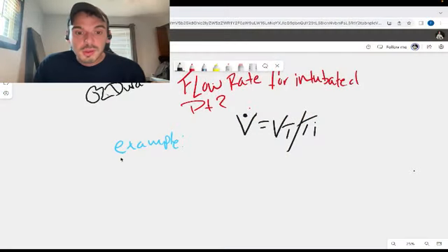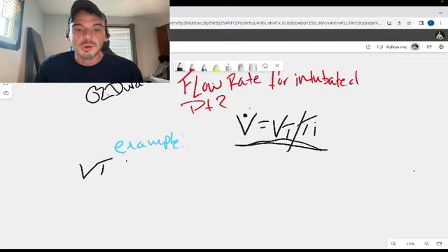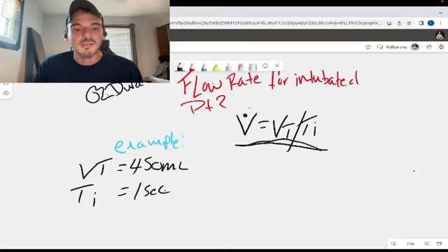So our equation here is flow is equal to tidal volume divided by our I time. And so let's play this out. So we have a 450 mL tidal volume patient set on volume, and we have a 1 second I time. So we want to sidebar here, end this whole equation in liters per minute.